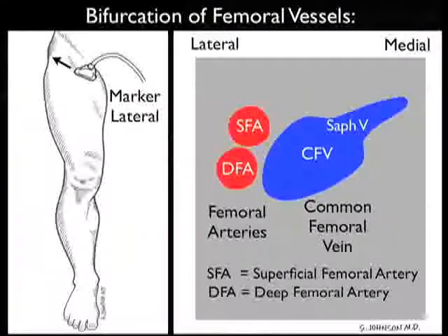It's very important to visualize the saphenous vein, as it's really the only superficial vein in the body that we worry about clot formation within, as it goes directly into the common femoral vein and can propagate up into the IVC and into the heart.